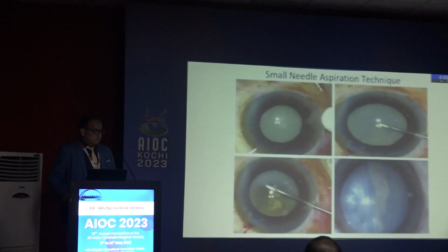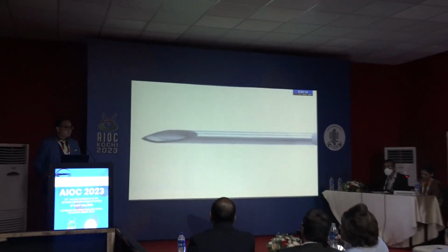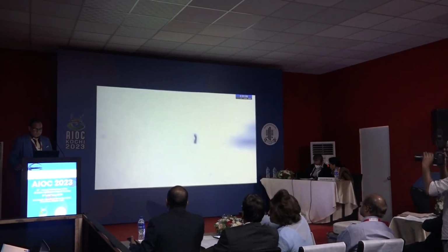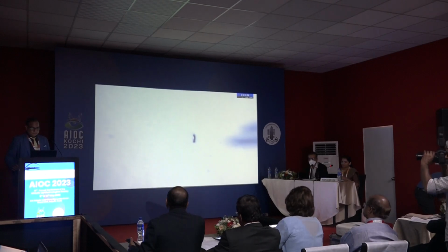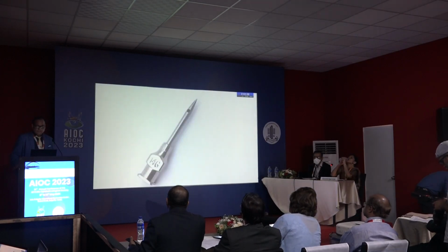of the capsular tear is still seen instantly after pricking the capsule with a hypodermic needle, even before the aspiration of cortex. So another factor, that is a linear cut configuration with discontinuous open edges made with a needle, is responsible too. The disruptive forces act along the axis of the linear cut, so the tear always extends radially along the open margins of the cut, but never perpendicular.